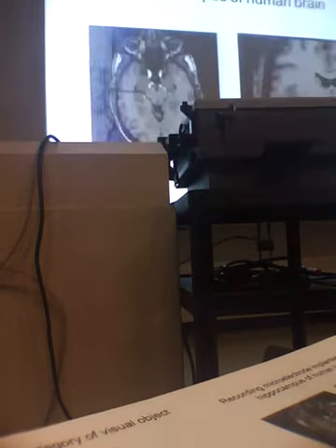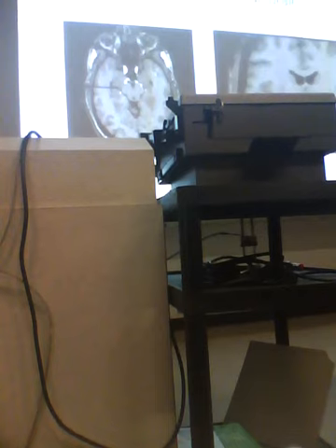This is largely done in animal work. It's a very, very common technique in animal research. And in humans, these single electrodes have been implanted into the human brain. And here's an example of an electrode in the hippocampus of a human. We don't do this to everybody. I mean, we wouldn't do it to any of you folks. This is done for a patient that's suffering from epilepsy, and they're using this electrode for the same reason that I talked about before. They're trying to identify the part of the brain, part of the hippocampus in this case, that's functioning abnormally.